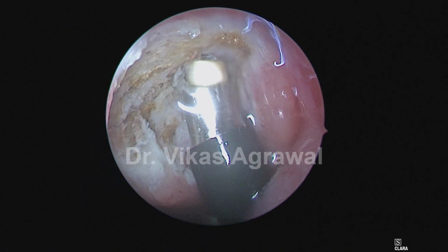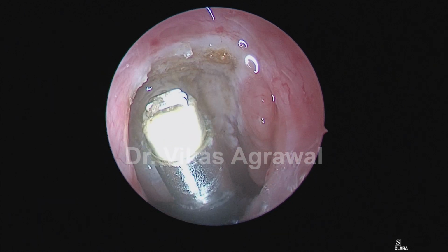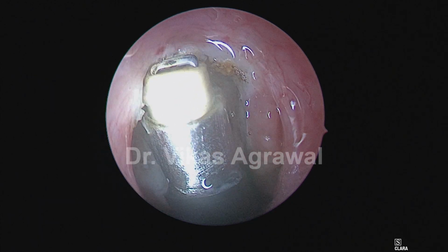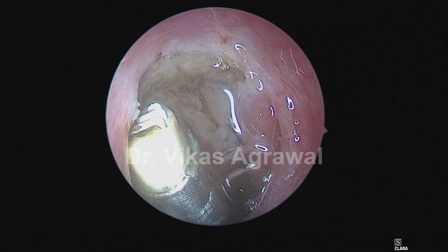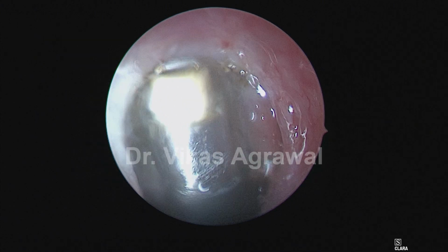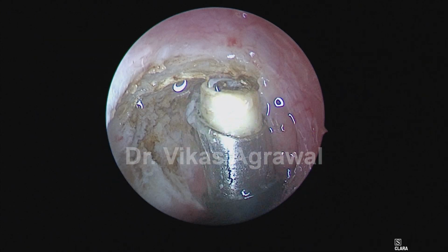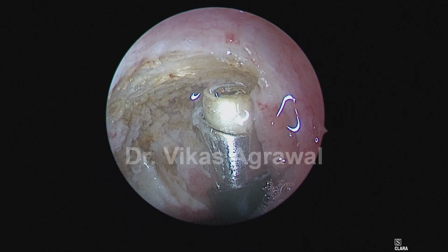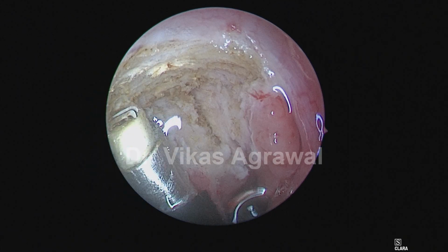Now you can see the superior boundary almost completely defined. I'll just remove whatever little is still pending. That's the periosteum below the sphenoid bone. This is the nasal septum, and we have completely removed the lymphoid tissues from the superior boundary here.